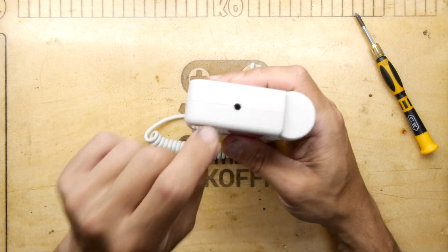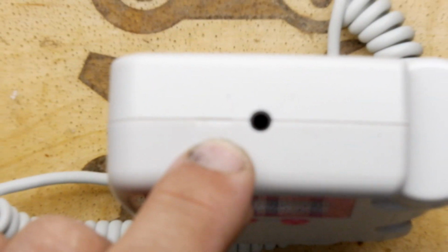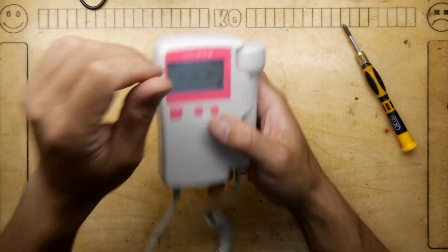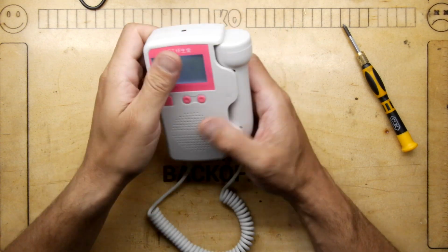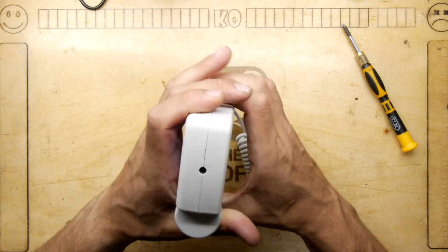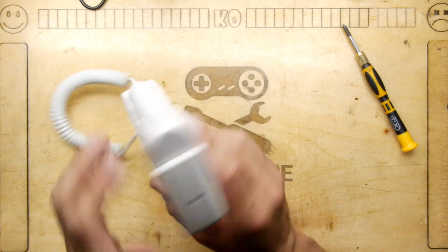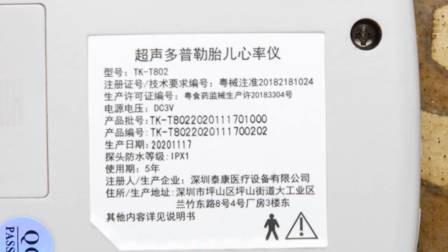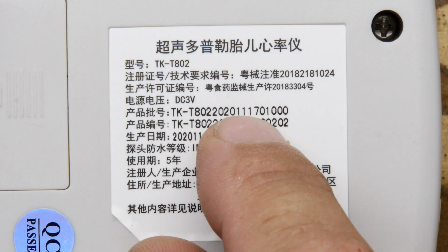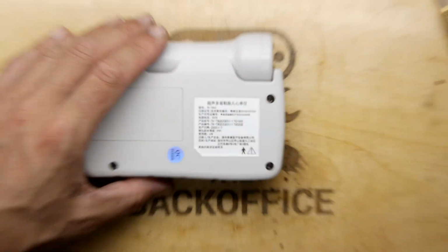I just noticed something here which is kind of useful. Look, it appears that there may have been variants which have a USB port. Now, I don't think it's anything exciting like a data capture or a record function. I think it's probably just going to have a rechargeable battery. But yeah, I might have a look on the interwebs and see what the USB variant would have. But just in case you wanted to know what the part number was, it is here. TK-T80-220-20111701001000. And with that breathless reading, I'll be off.